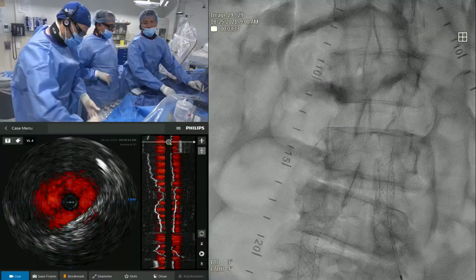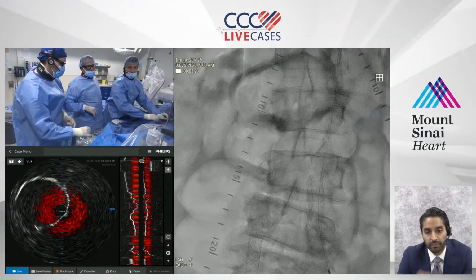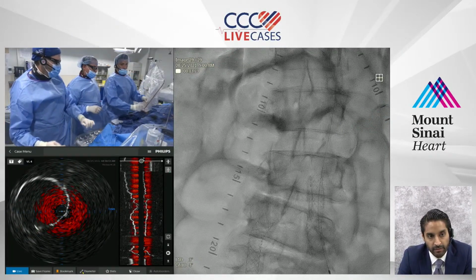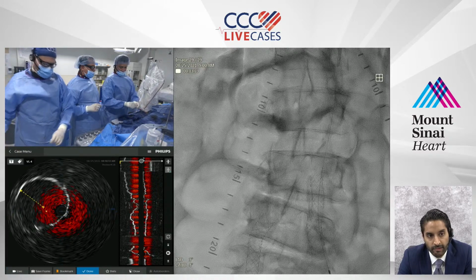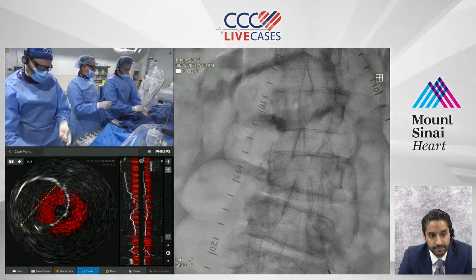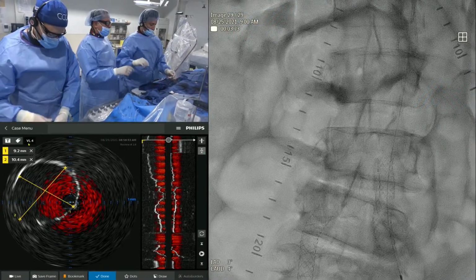I would post-dilate the ostium. Is there currently a pressure gradient between the sheath on the left femoral and the right radial? That's a great point. We're just going to check. Take out that wire and just go through with this wire. Actually, leave it side by side. Let's go side by side.